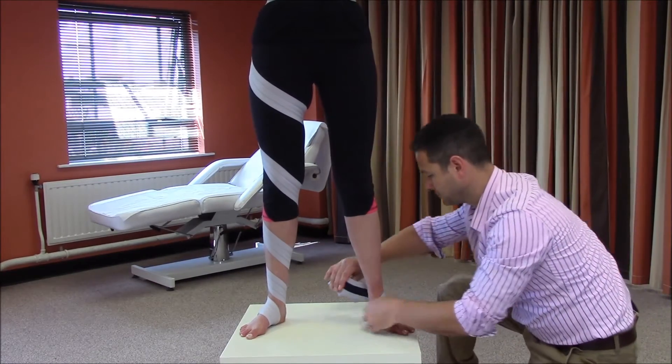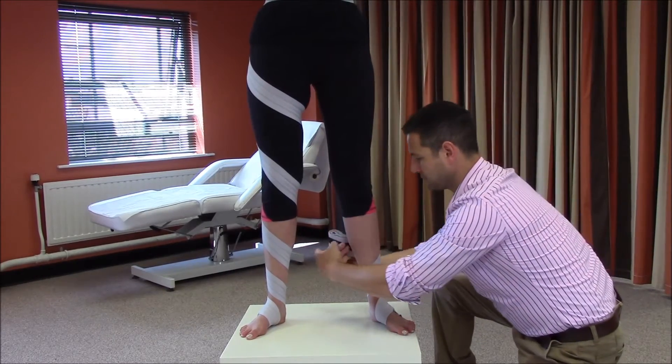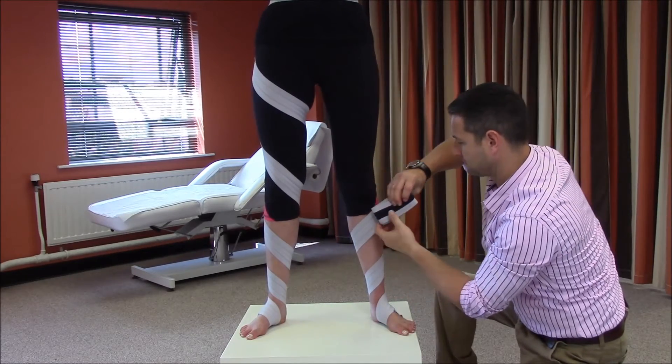You may notice that I have externally rotated the foot prior to donning the strap. This increases the degree of external rotation during gait.